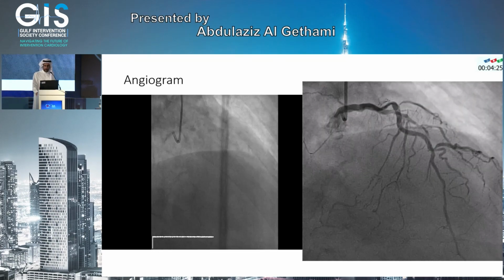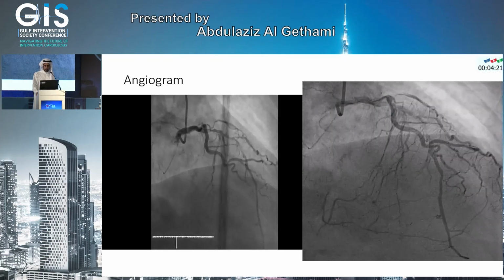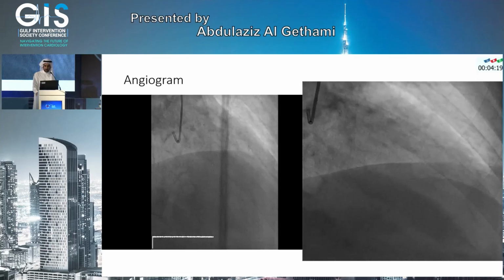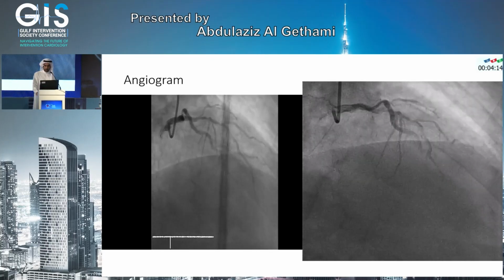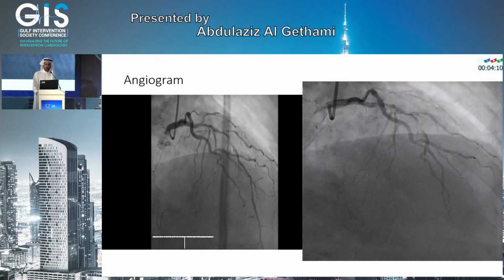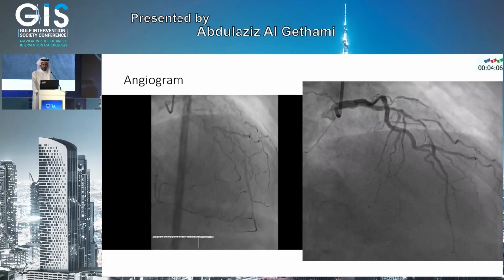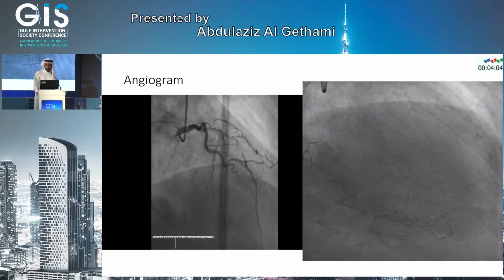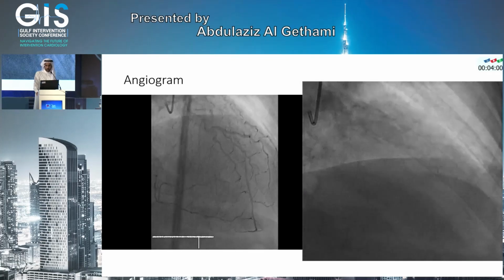Now, can you afford doing this case without intravascular imaging? Would this be good practice, or is it at all affordable? I think if you're in the lab and you're planning to do a complex lesion like this calcification, we cannot do it without imaging. And I think we're going to beat the surgeon with our multivessel PCI by doing it appropriately. And you cannot do it appropriately without imaging.